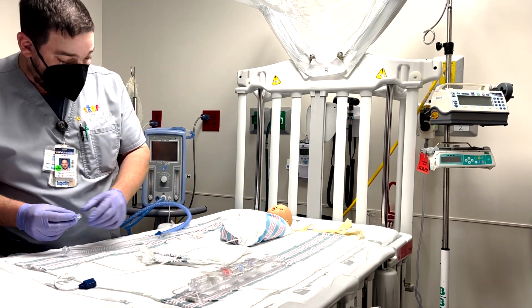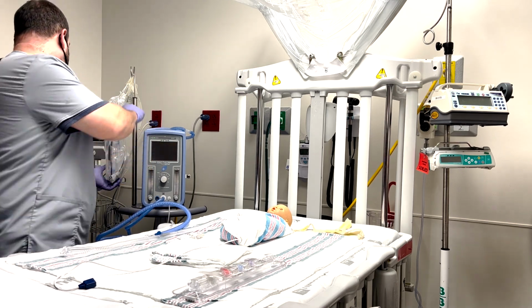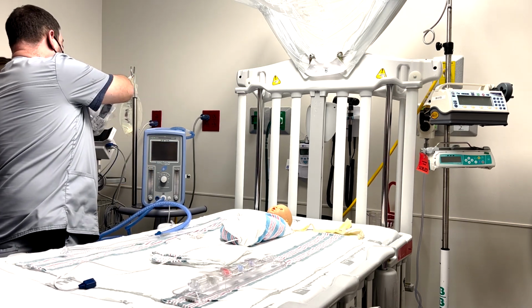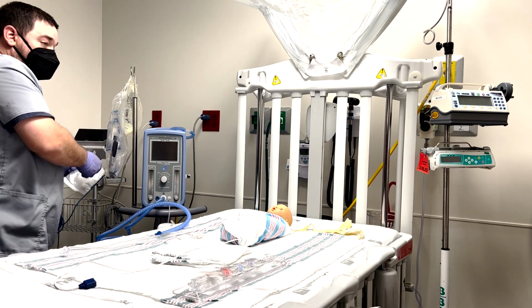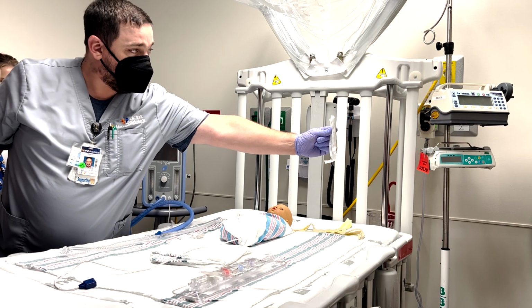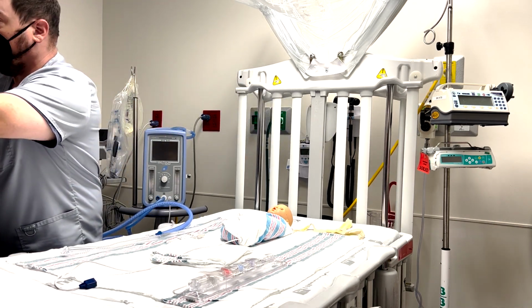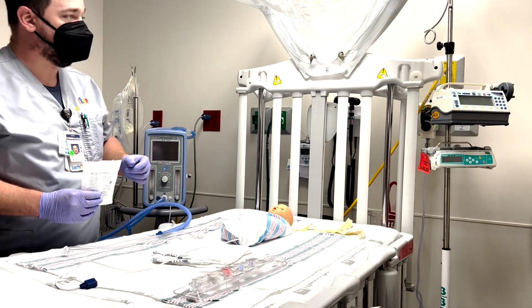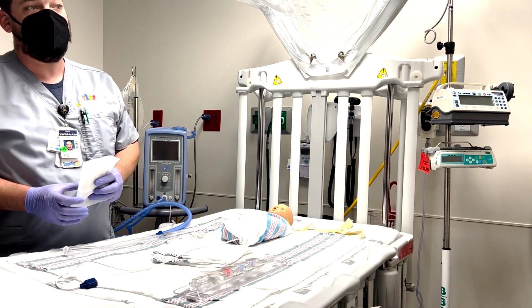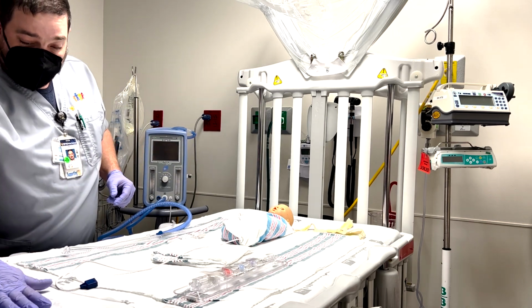Most important measurement that you have to have with your patient is head circumference. There's a reason for that. So we'll pick our headgear. If you'll notice in the top corner here, it gives you what size each of these should be. Okay, so our top size on this is 42 cm. So if you've got a little melon that's more than 42 centimeters, we can't do nasal CPAP. We've got to consider other options. That's why we have that.